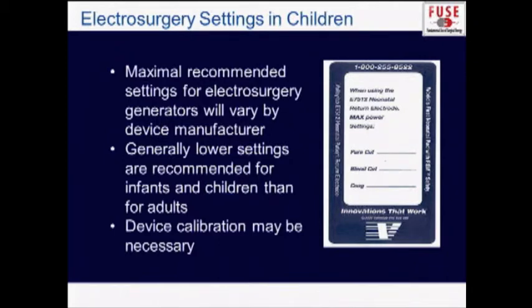Now, I will say that in pediatric surgery, I operate on from 500 gram preemies to 500-pound teenagers, and I rarely use power settings that are above 10 or 15. And you can get the results that you want even in the larger teenagers.